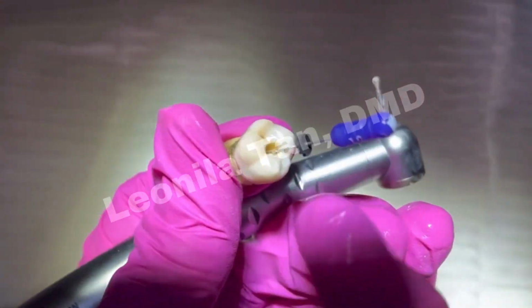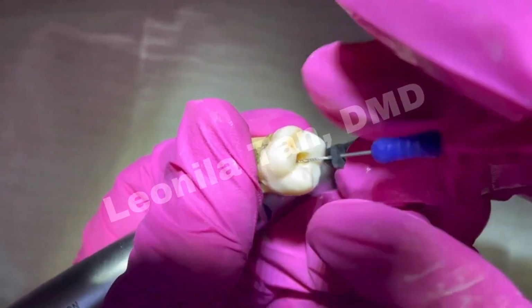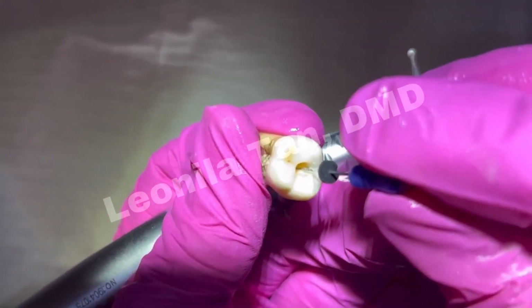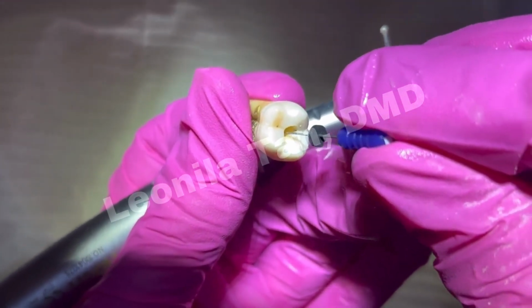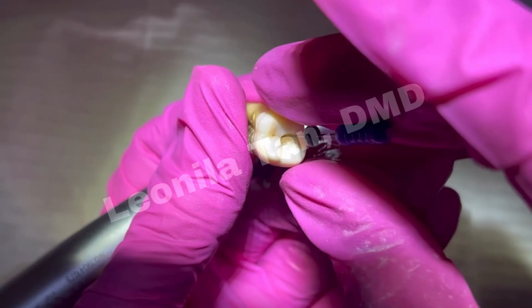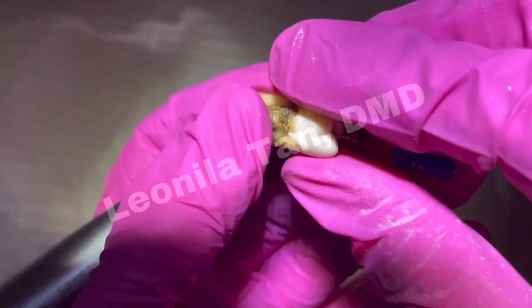Once in a while, get your number 10 file at your tentative working length and see if it goes into any of your buccal canals. Here, notice it's going toward the buccal side.